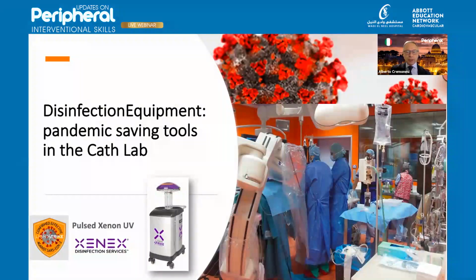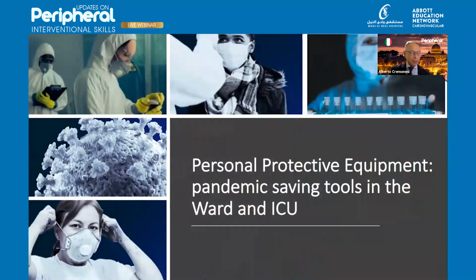And for every patient who entered our cath lab, we had to disinfect the lab itself, and we used pulsed xenon ultraviolet systems, which is very fast but very effective for COVID.